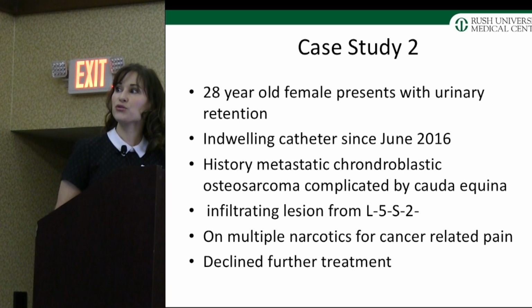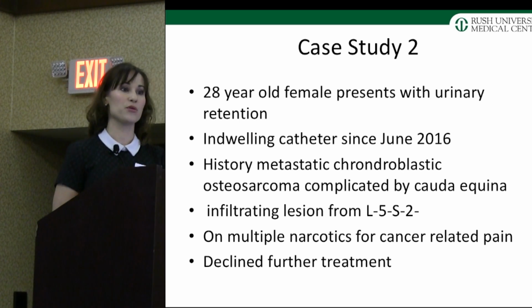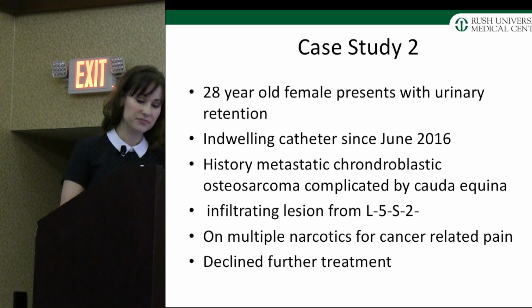Case study number 2, this is a 28-year-old female. She came in with urinary retention. She had a catheter in since June of 2016. She does have a history of metastatic chondroblastic osteosarcoma complicated by cauda equina, and she was very unhappy with this catheter being in.